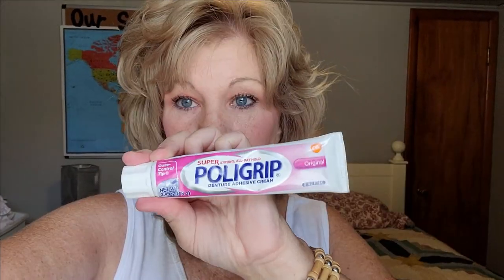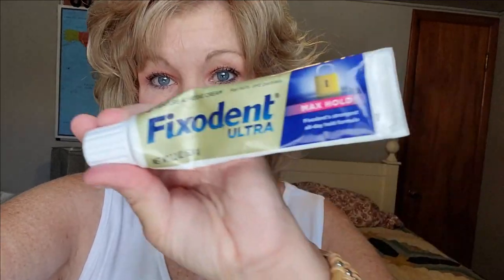I don't gag as much, so I carry lifesavers with me all the time. I have Polygrip, and I also have Fix-A-Dent, and also Fix-A-Dent Gum Care. I like all of these but I use them at different times — it depends.